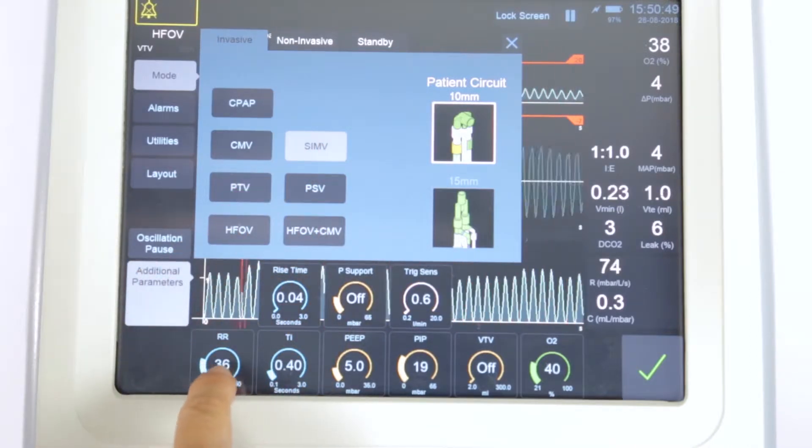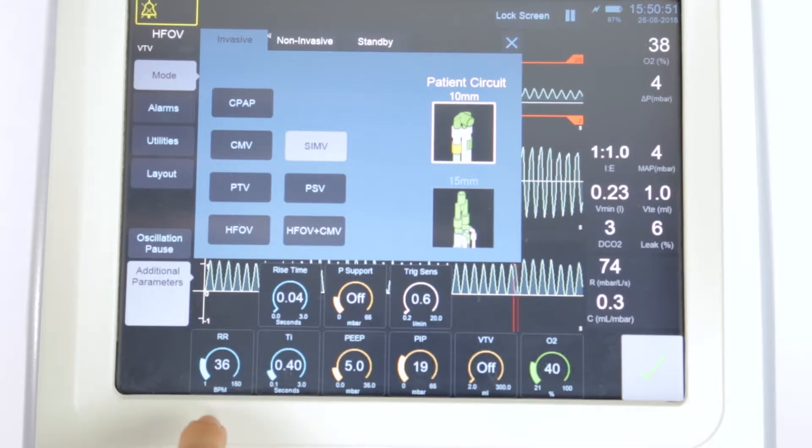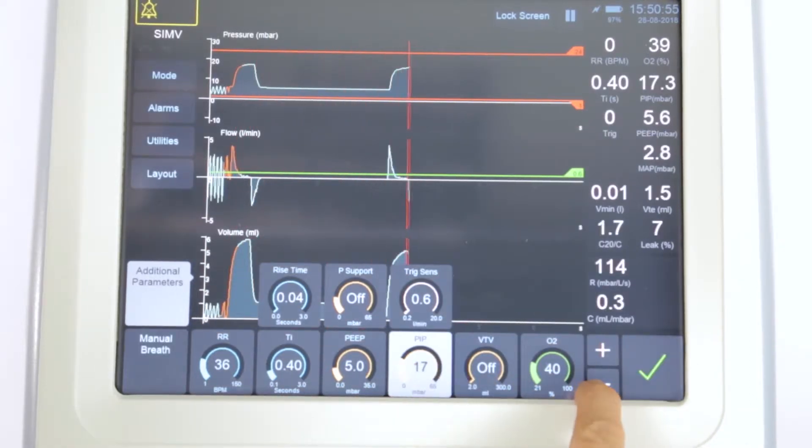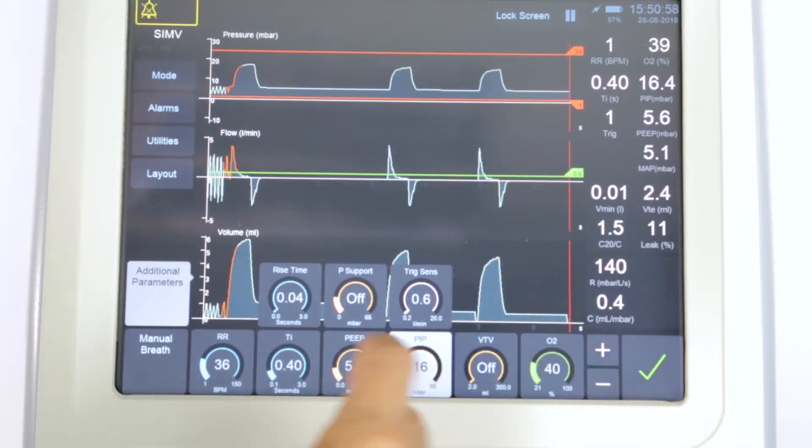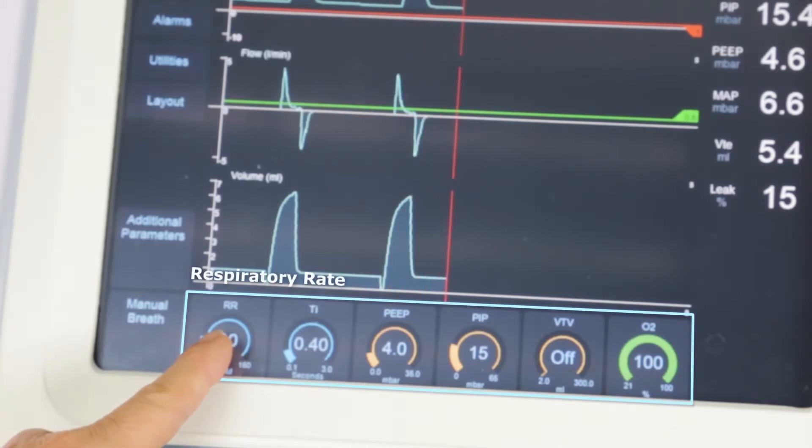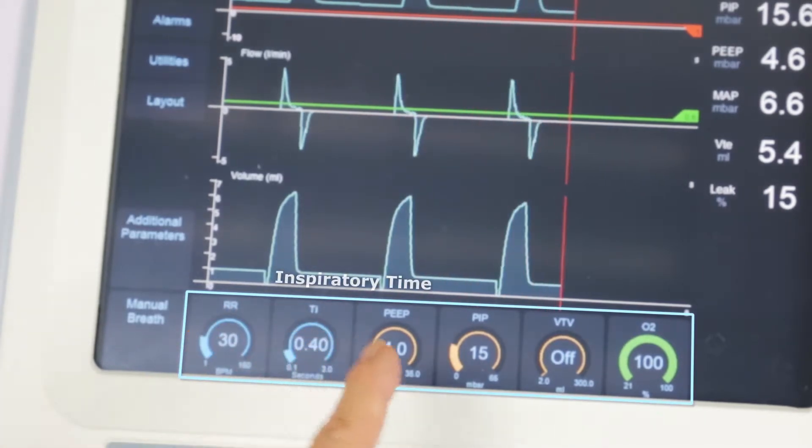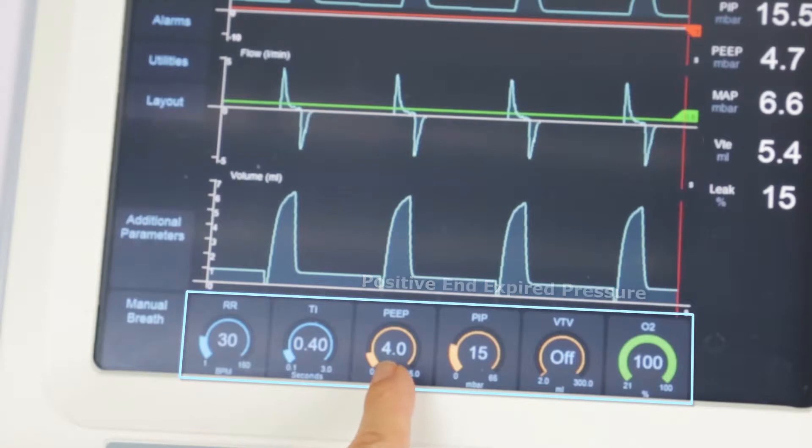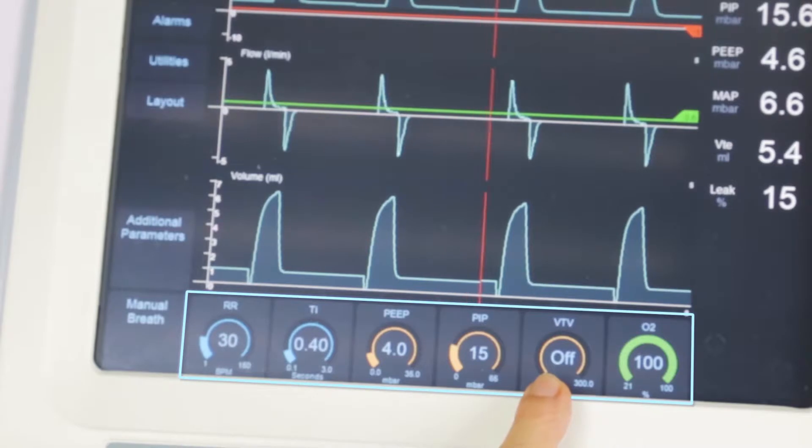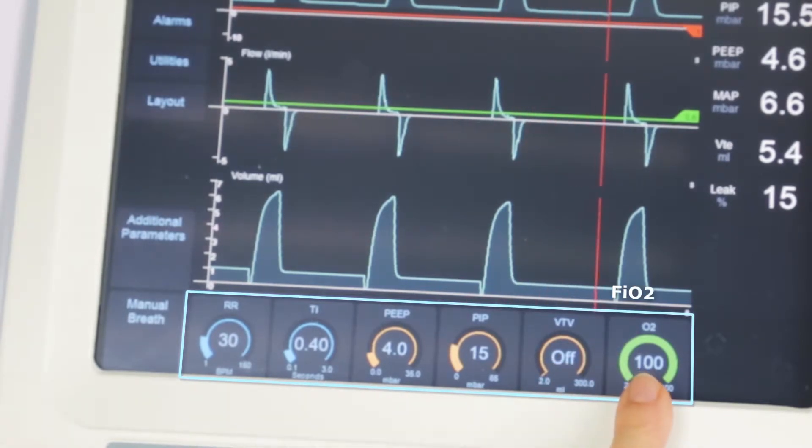Once selected, the settings window will be displayed, along with additional parameters. Set your parameters in accordance with the clinician's orders and the infant's condition. You will set respiratory rate, inspiratory time, positive end expiratory pressure, peak inspiratory pressure, volume-targeted ventilation which is optional, and the fraction of inspired oxygen.